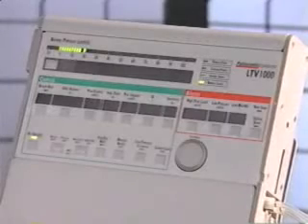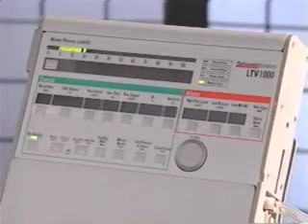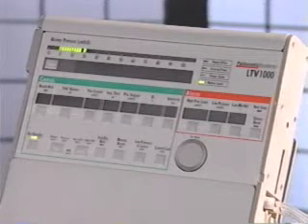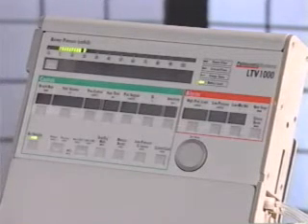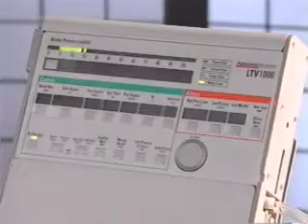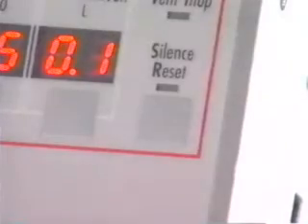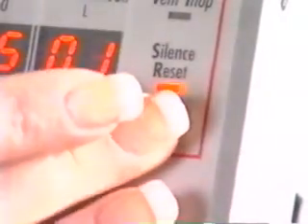After 60 seconds, the displays are turned off to conserve battery power. To reset the power lost alarm, press the silence reset button twice.